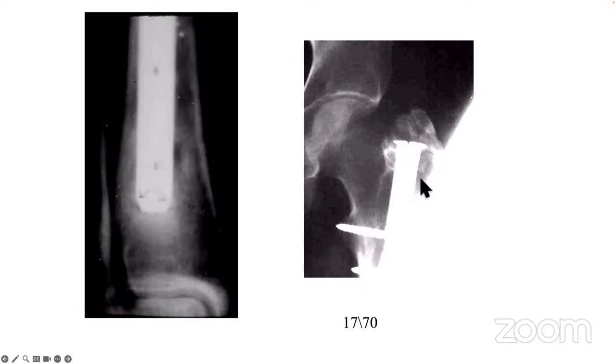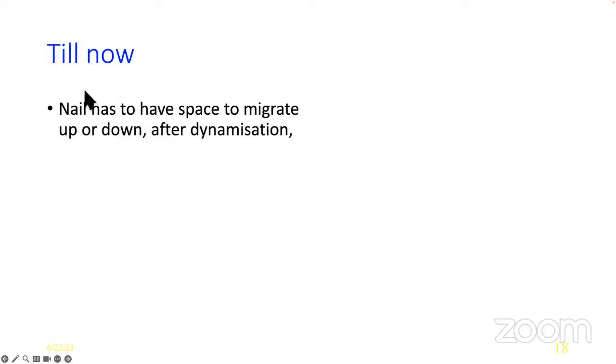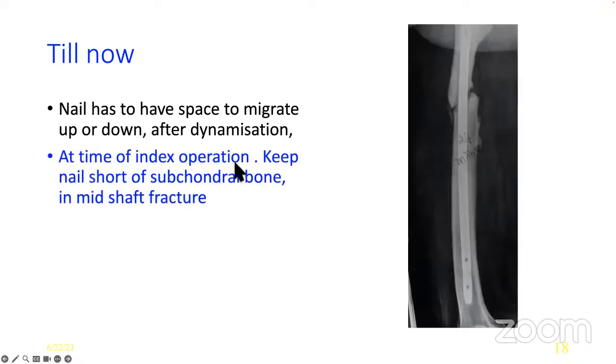And for dynamization proximally, if bone formation has occurred, it will not be possible to do the dynamization. So the nail has to have space to migrate up or down after dynamization. At the time of the index operation, keep the nail short of the subchondral bone in a mid-shaft fracture. You can keep it short and allow it to dynamize if you want to dynamize later on.